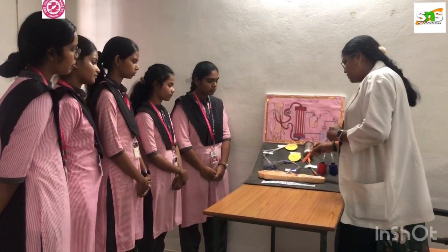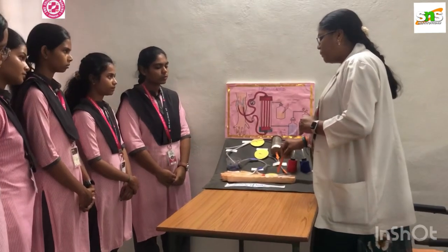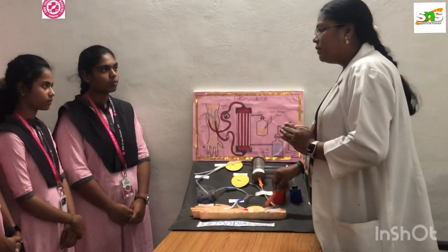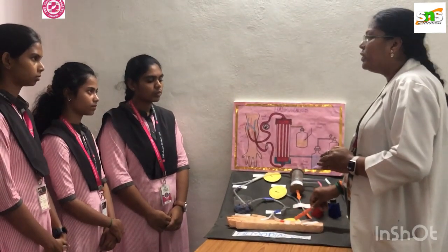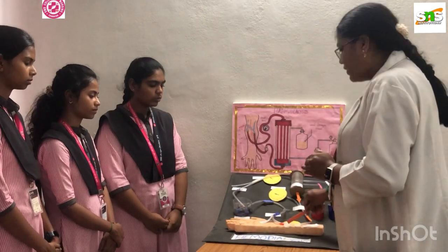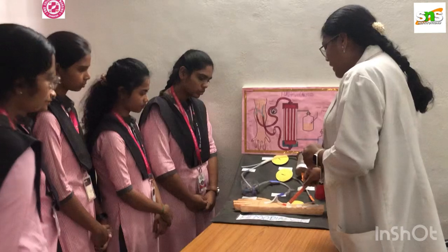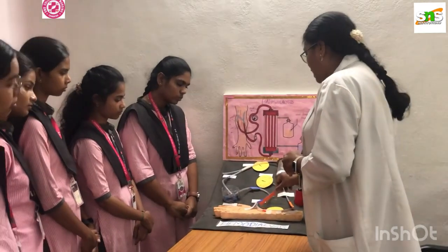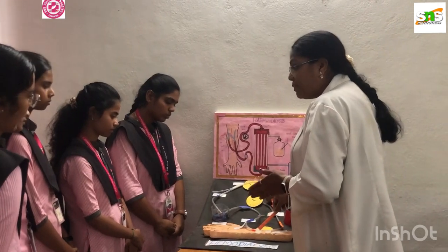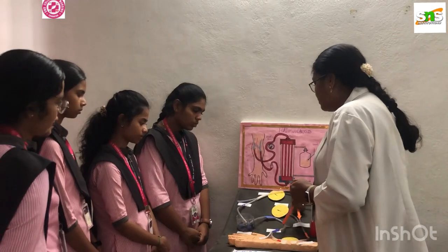Have you seen a patient undergoing dialysis? The patient might have an AV fistula. AV is artery and vein combined together so that one point of entry and exit can be achieved. You can come closer so that you can see this. The blood from the artery is being taken up and removed. The blood from the vein is also taken up. This is the blue mark, right?